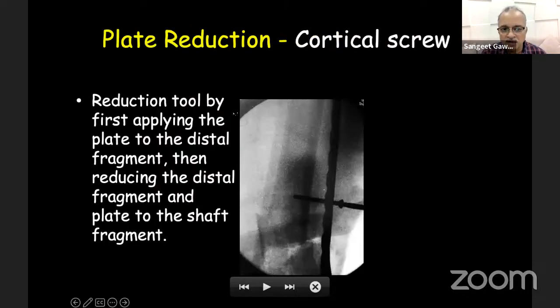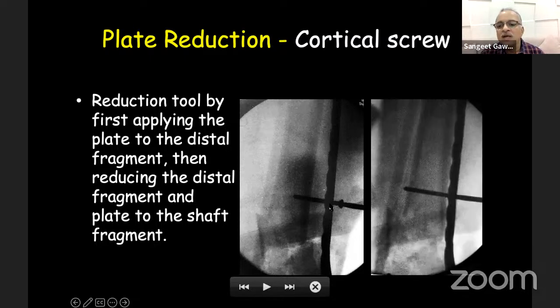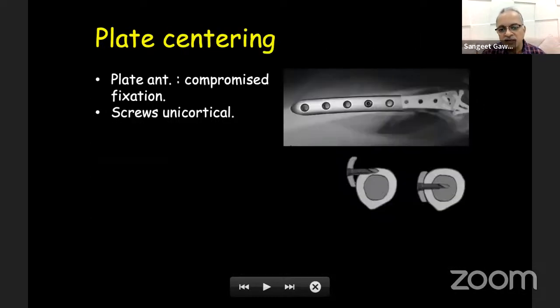So the reduction tool for the shaft, what can be used is a cortical screw, which will bring the shaft towards the plate. Thereby, the plate will sit properly on the lateral side.